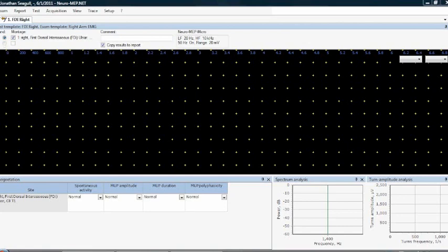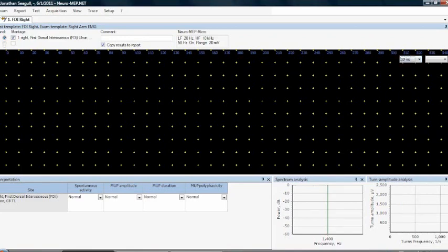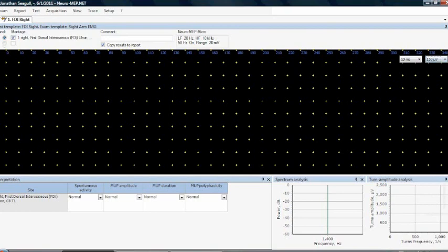First of all, this is the screen that shows you where the motor unit potential is going to be displayed. Here you can set up the sweep speed that you want to use. I usually use 10 milliseconds per division. And let's set up, for instance, the gain that you want to use. I usually use anywhere between 150 or 200. Let's say 200 at this point. So this is a screen that's going to display this right now, as you can see. And it's going to tell you you're doing the right first dorsal interosseous muscle. It's ulnar innervated and C8T1. It shows you the filters that you'll be using, 20 hertz for the low filters. High frequency is 10 kilohertz, and so on and so forth.